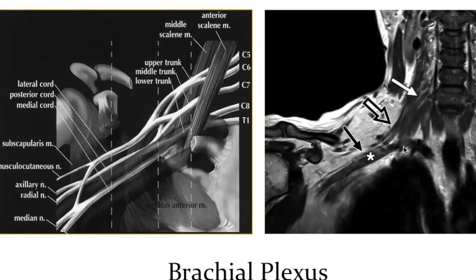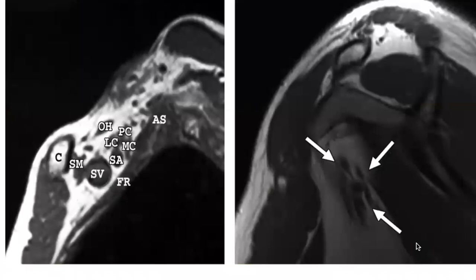This is a coronal oblique T1 image showing the components of the brachial plexus. These are the roots, and these are the levels of the scalene muscles where we see the trunks. The divisions extend from the outer margin of the scalene muscles up to the level of the clavicle. The divisions then form the cords, and the asterisk here marks the subclavian artery. The cord medial to it is the medial cord, the lateral cord, and the posterior cord.